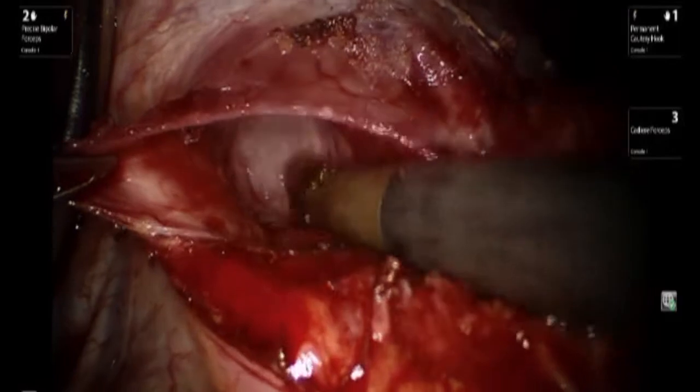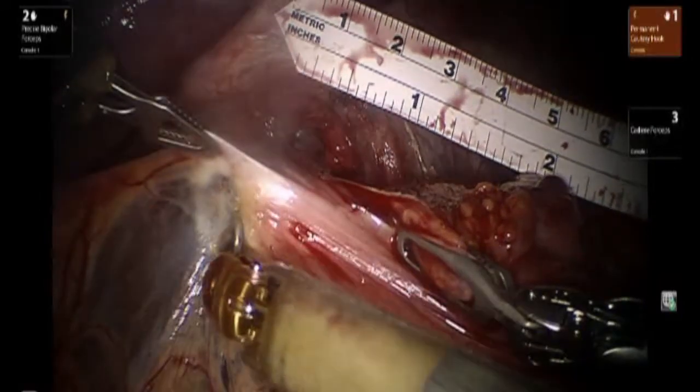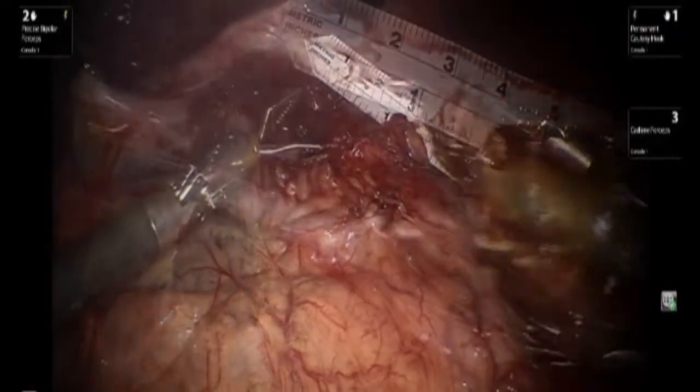Dissection continues in the posterior mediastinum in order to have at least 6 cm along the esophagus. We then open up the gastrohepatic ligament to visualize the right crus.